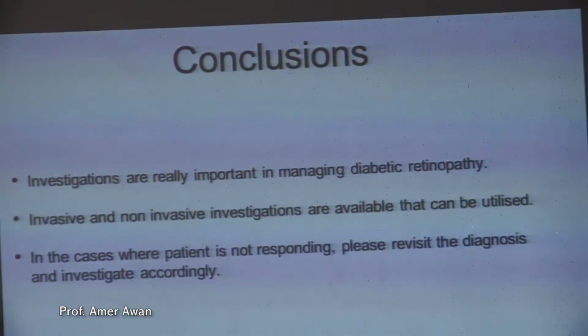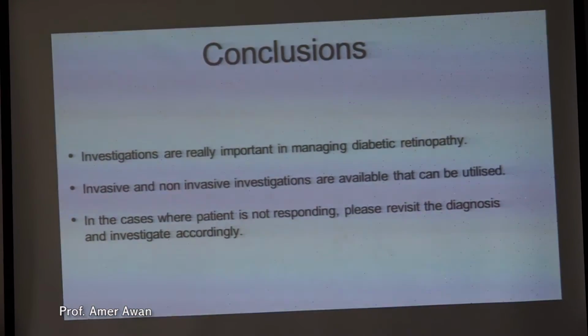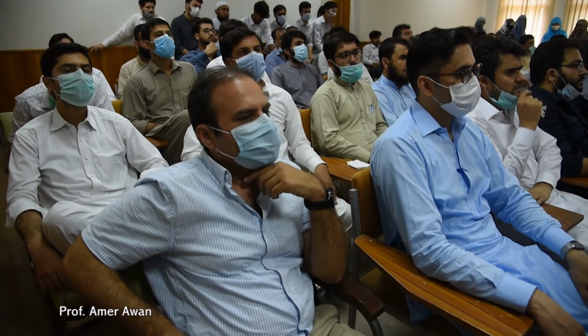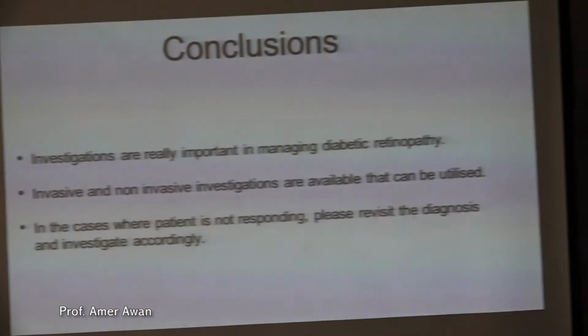So in conclusion, I think investigations are really important in managing diabetic retinopathy. And in a good retina practice, you need to have all these gadgets with you so that you can diagnose the patient and manage them properly. Invasive and non-invasive, both investigations are available. Initially, you start with the non-invasive one, but where you require invasive, I think it's really important to do them, to diagnose the patient. And especially if the patient is not responding, please revisit your diagnosis.